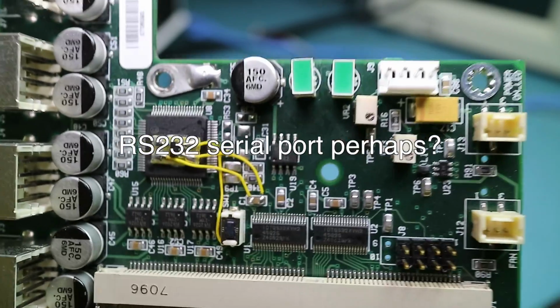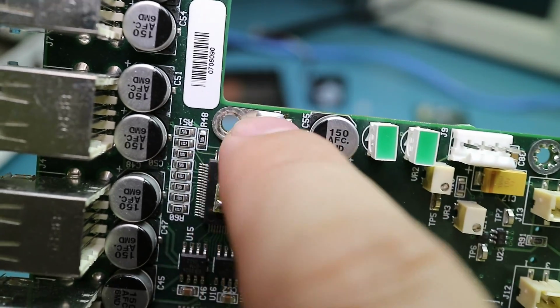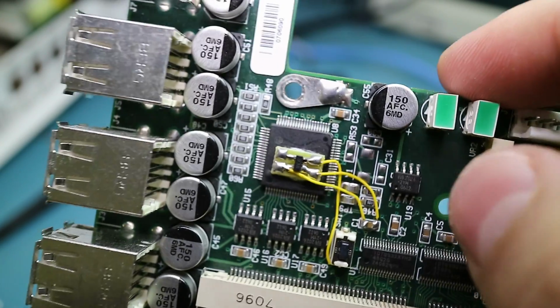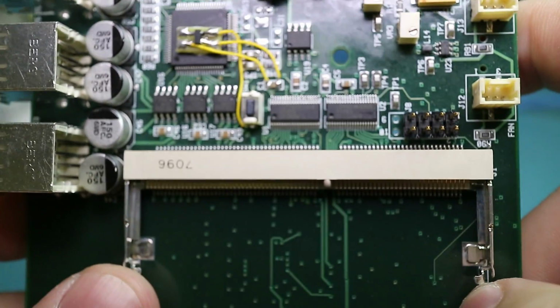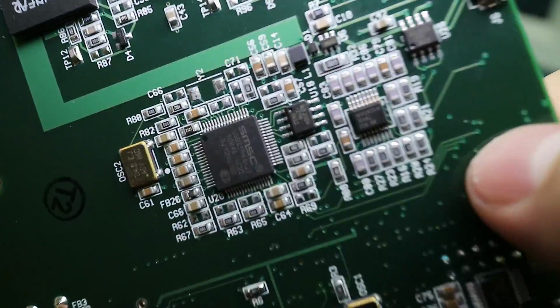This is what the mystery connector at the bottom of the case plugs into. And you can see this little eyelet here has been put on for some extra grounding. And we've got some nice big caps along the USB ports. And it looks like it's just a regular SODIMM style connector. There's some dates on this, which puts it around 2007.